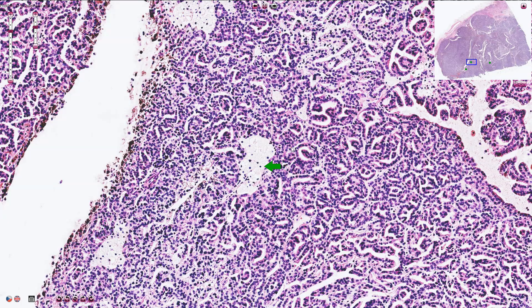A very useful sign of papillary renal cell carcinoma is the focal accumulation of foamy macrophages, also visible here and here.